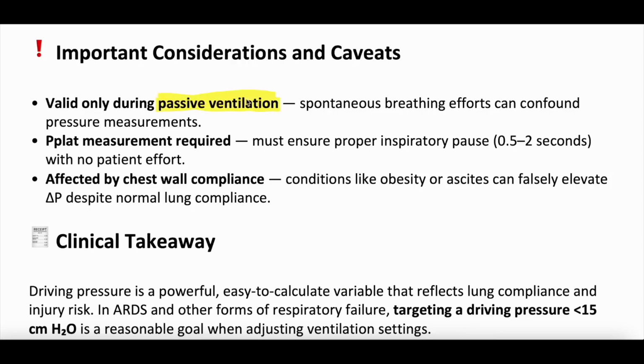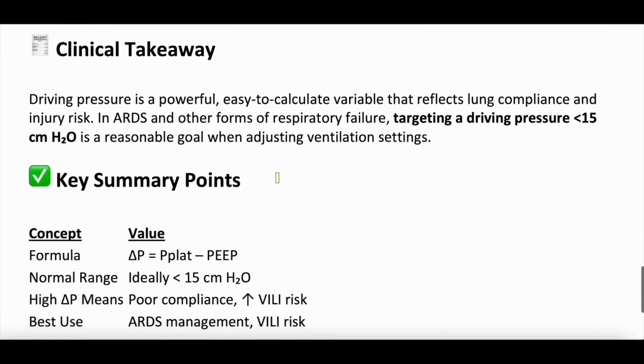If the patient is breathing a lot on their own, they're dyssynchronous, what have you, you can't really do this. It confounds the measurements. You need a plateau pressure to do this, so you have to measure the plateau pressure appropriately or your driving pressure will be off. And just remember, this is affected by chest wall compliance. Although the driving pressure takes some of that out of the equation, it still does take it into account a little bit.